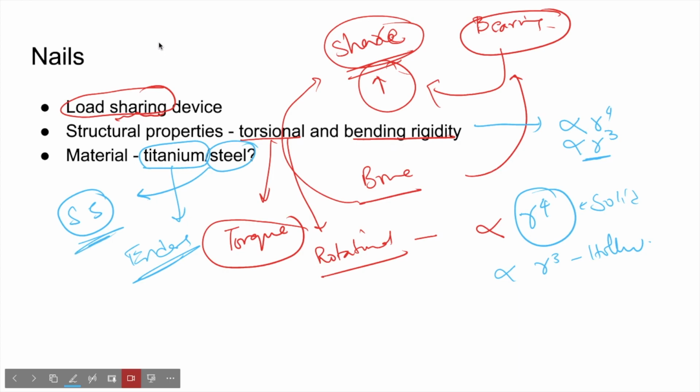Right? What is the radius of curvature? We all know that there is a small radius of curvature for the femur nail. It is usually greater than the actual curvature of the femur. So this is the radius of curvature. It is present in most of these femur nails, and there is a lot of variation in different types of nails as well.